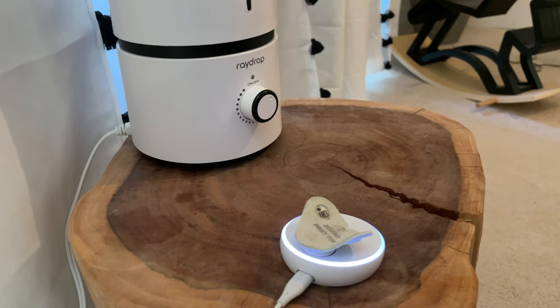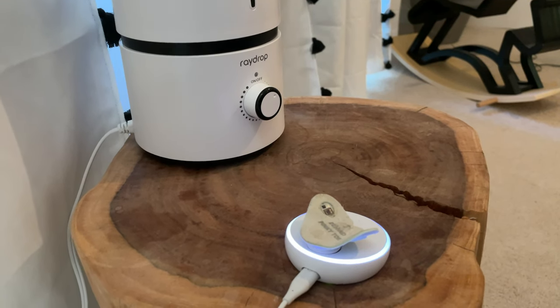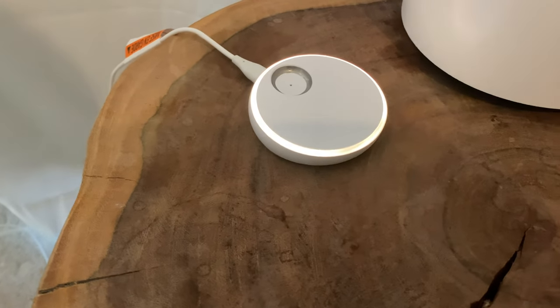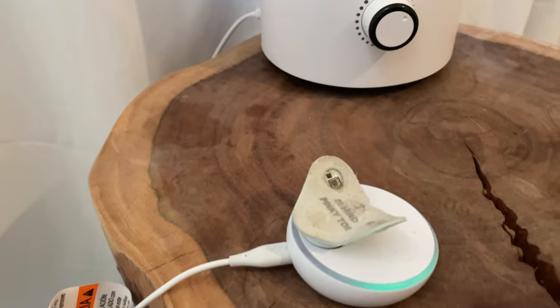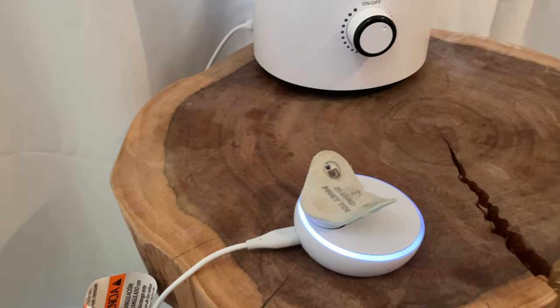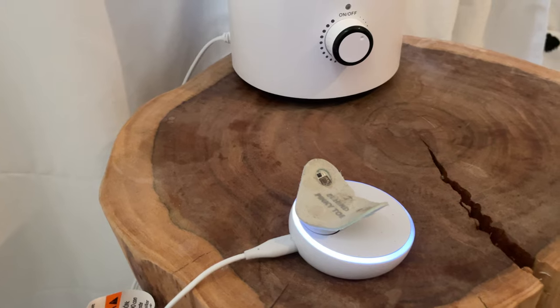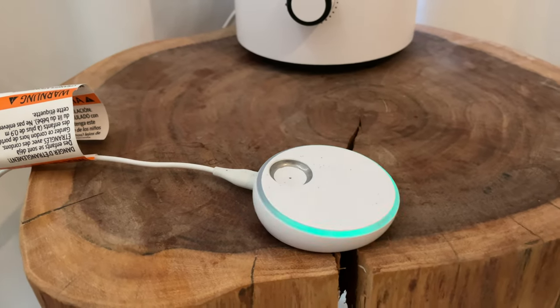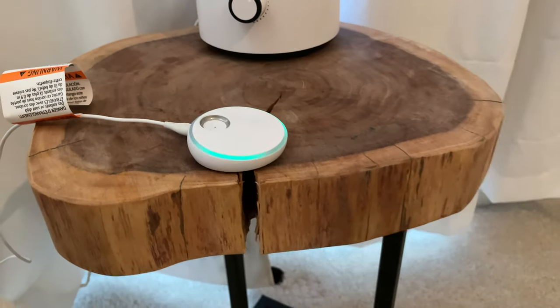The charging dock itself provides the same information as your phone app using the LED ring on the dock. White means the sock is charging; yellow means the sock isn't properly on or has been knocked loose; blue indicates the connection is lost and it's trying to reconnect; red means something is out of the ordinary — the oxygen or heart rate is outside the normal range and you should go check on your baby; and green means it's connected, charged, and everything looks normal.